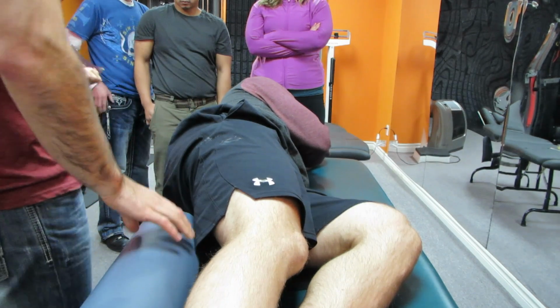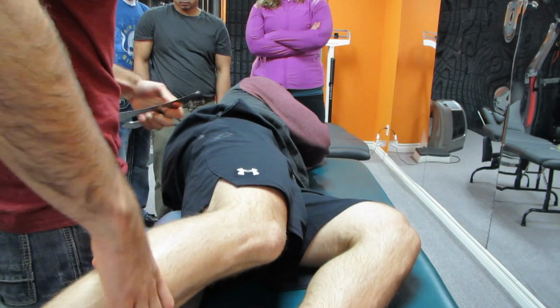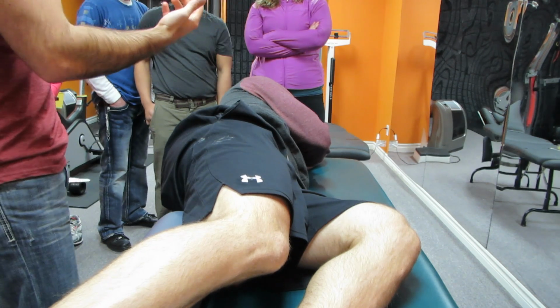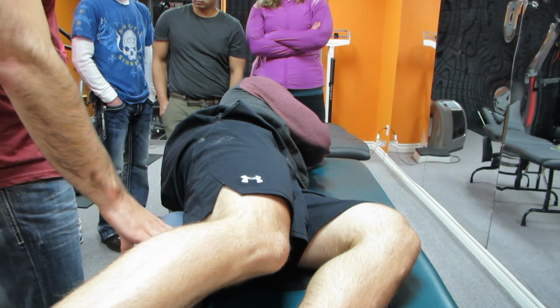But for now, if you guys aren't comfortable using opposite hands, that kind of stuff, it's easy enough to just get his leg and rest it on a little bit of something. If we allow it to drop too much, we're going to get a little bit too much tension. But if we bring it into extension, we'll be laughing and everything's fine and dandy, okay? Get your roll onto your back.